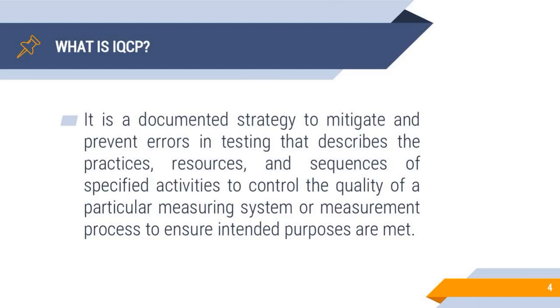What is IQCP? It is a documented strategy to mitigate and prevent errors in testing that describes the practices, resources, and sequences of specified activities to control the quality of the particular measuring system or measurement process to ensure intended requirements are met. In another way, it is a strategic plan that takes care of the quality of the whole process of the specimen, from pre-analytical, analytical, and post-analytical, with all the related policies or quality control processes, to ensure the results are accurate and reliable.